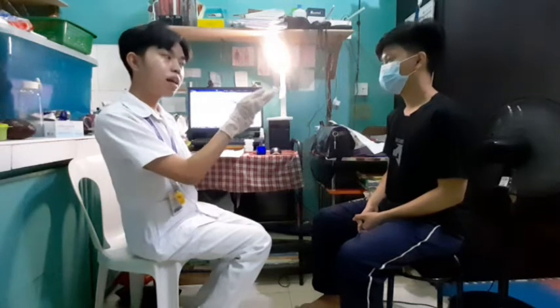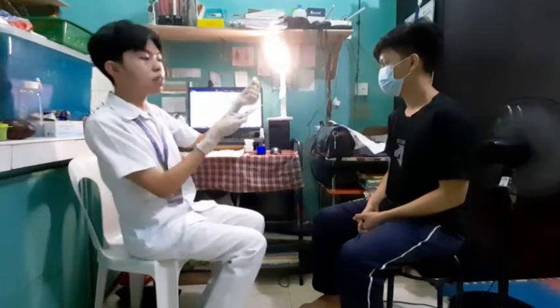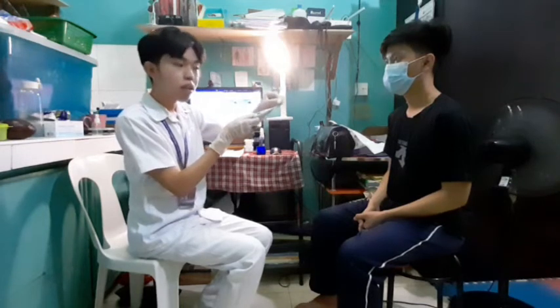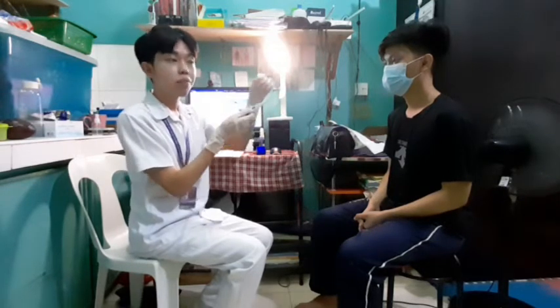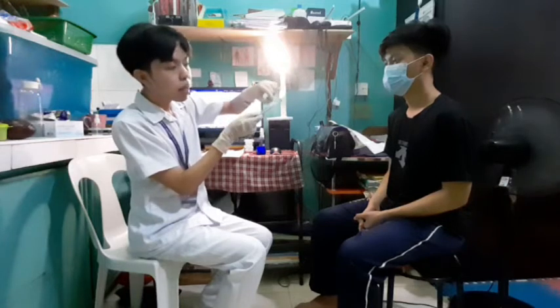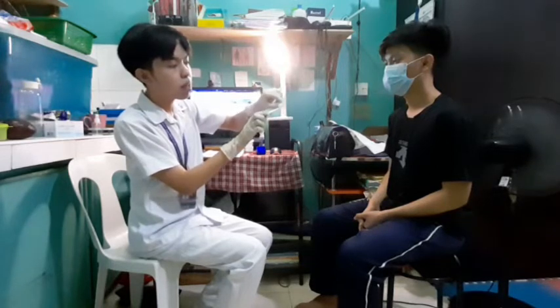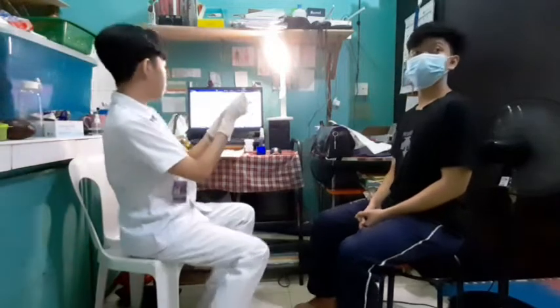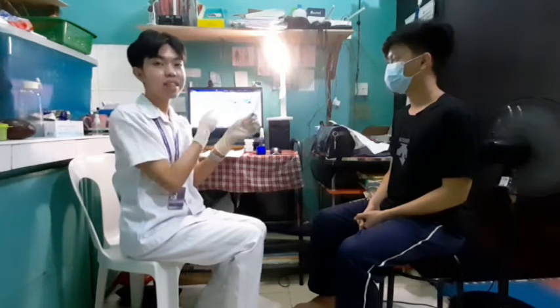I have removed the thermometer from inside the client's mouth and will now sanitize it again. Using an alcohol swab, the technique for cleaning after use is from the probe of the thermometer up to the body with a firm circular motion — entirely cleaning the thermometer. I'll start with the probe and go towards the body, circular motion around the thermometer. Done. I'll discard the cotton. After that, this is subject to another washing to ensure it is clean for another use. I will then place the thermometer inside the appropriate container.